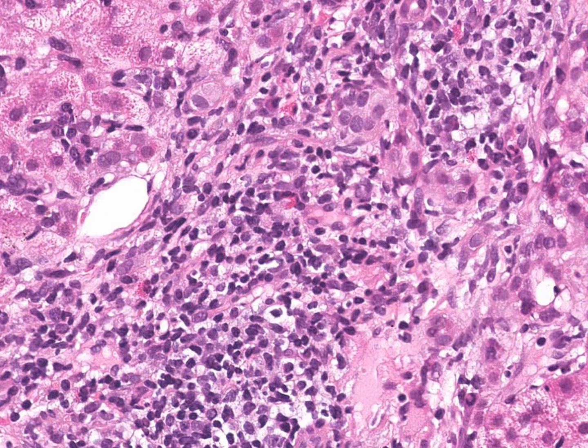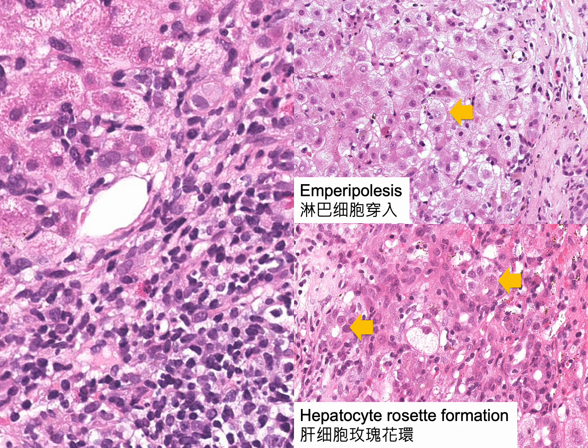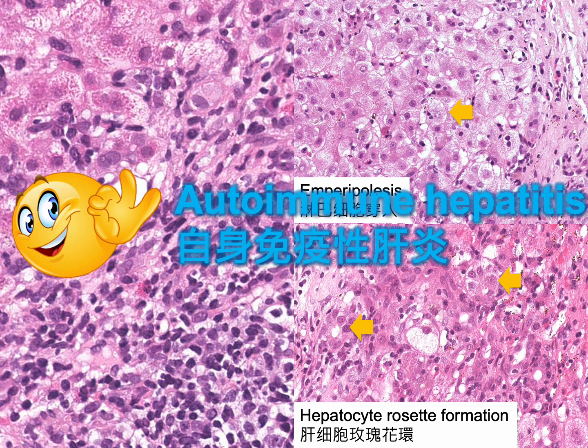This example also demonstrates lymphocyte predominant portal inflammation as well as interface hepatitis. If emperipolesis and hepatocyte rosette formation are revealed, the overall histological picture is typical for autoimmune hepatitis. Certainly, we have to correlate with serum immunoglobulin and autoantibodies.